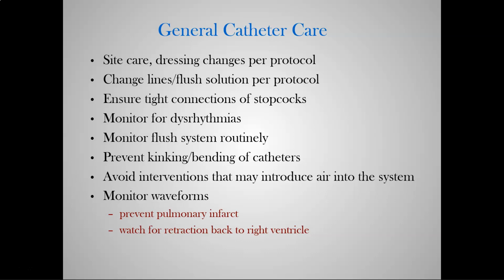Maybe I had to advance it. Maybe I had to pull it back. We're not talking about a Swan-Ganz here. But if I move that dressing off, I'm just going to sterilize and redress. We don't want central line infections.